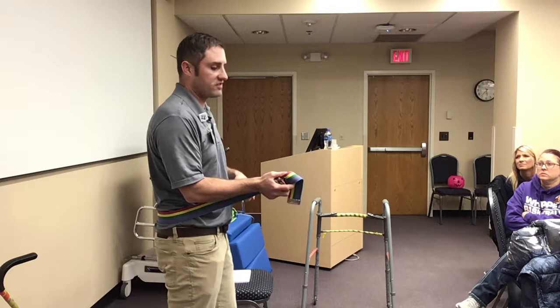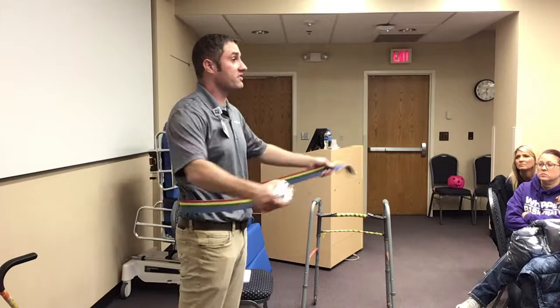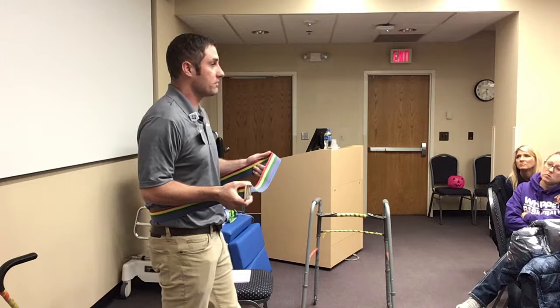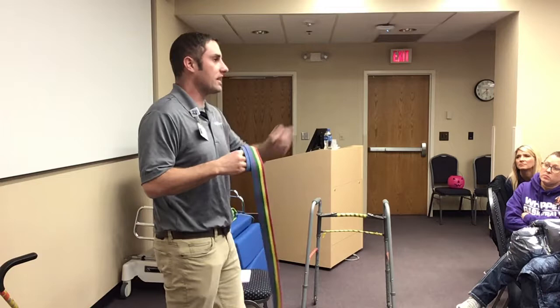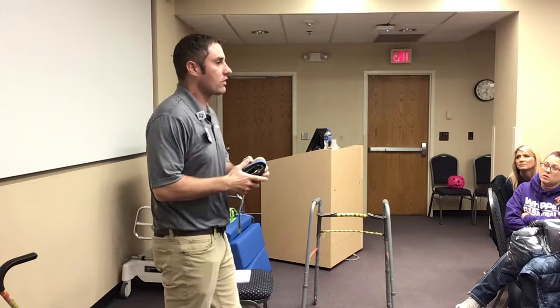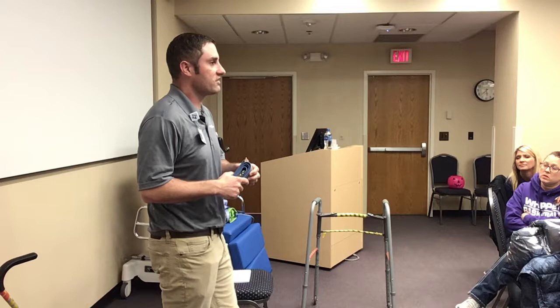When you go to assist somebody with the gait belt, body proportions kind of change from sitting to standing, so you will have to adjust it on just about everybody when they go from sitting to standing — tighten the gait belt when they stand up. Do not lift or pull if you can avoid it. Let the patient initiate it and just use the gait belt to guide them. If you have it around their waist, you can really help at their hips — as opposed to under their arms, which offers less leverage and is just more uncomfortable for the patient.